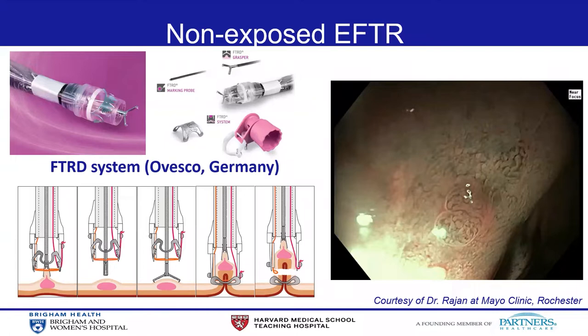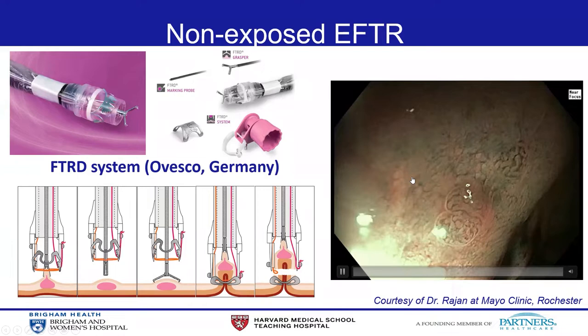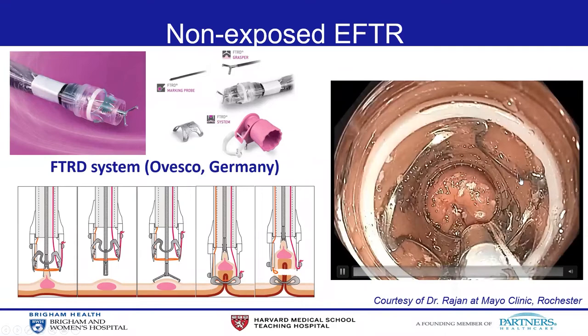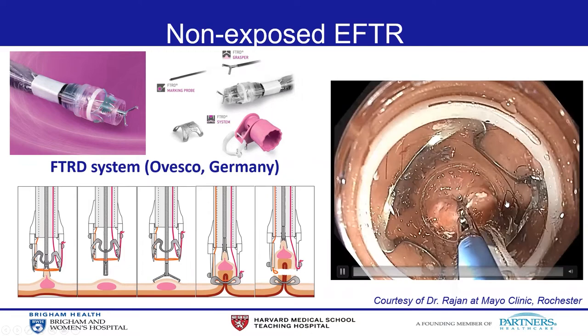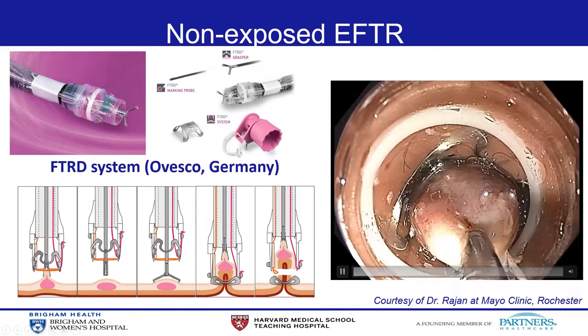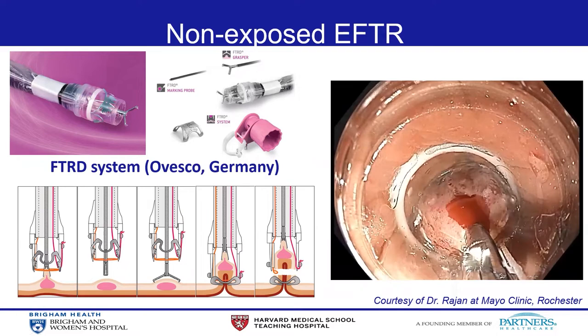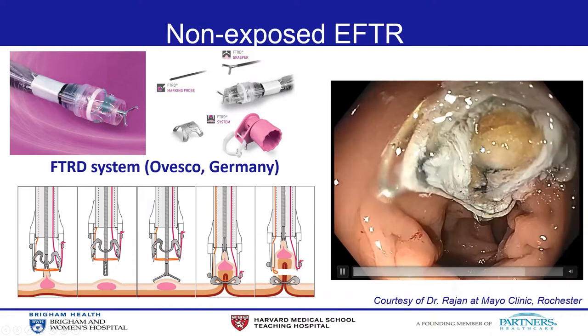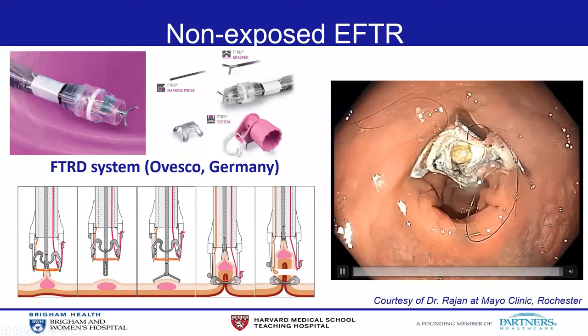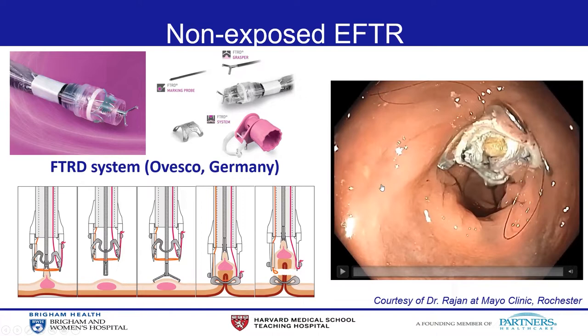I'm going to show the device we currently use for non-exposed EFTR. This is called the FTRD system, developed by Ovesco, which incorporates the 21mm Ovesco clip with a hot snare. The procedure starts with full-thickness plication using the Ovesco clip, followed by full-thickness resection with the hot snare. Here is a case video showing local recurrence of high-grade dysplasia in the sigmoid colon. Following marking, the target lesion is pulled into the system using a grasper, the Ovesco clip is deployed, and the lesion is removed. The full-thickness resection defect is visible, and the Ovesco clip has completely closed the defect.